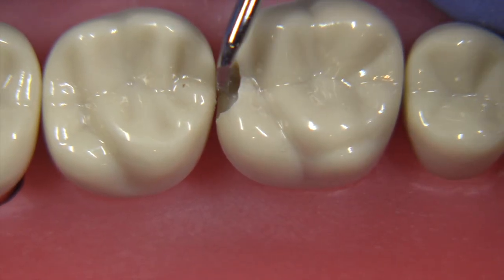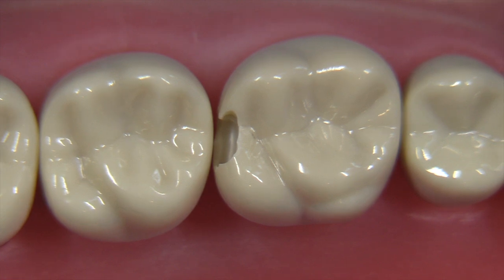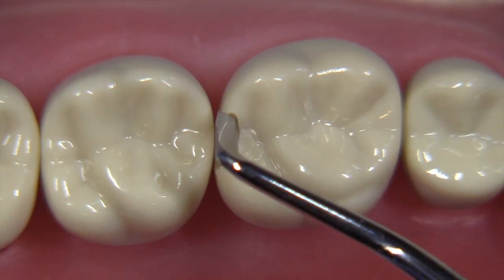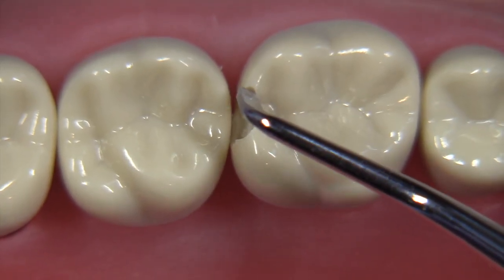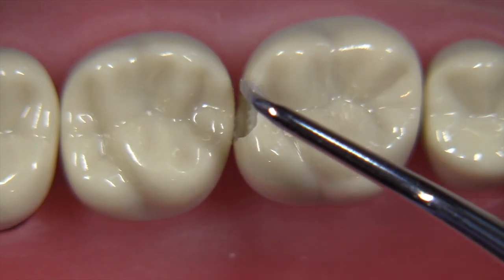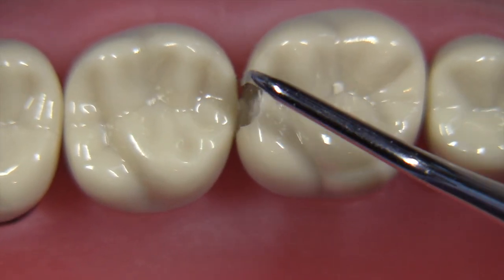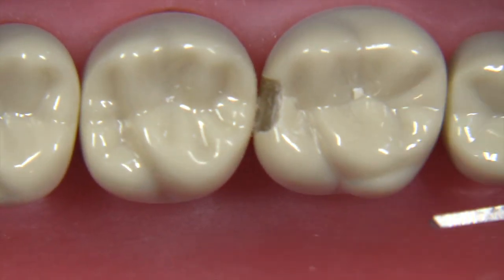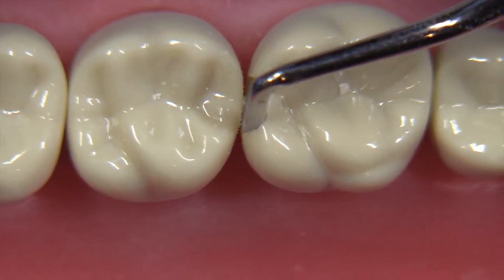The tooth was a little loose so I had to tighten it up a little bit more before finishing this video, but you can see the move that's required. It's really critical that the hatchet be sharp. This happens to be a 10-6-14 enamel hatchet; the 10-7-14 enamel hatchet is almost the same except it's slightly longer.